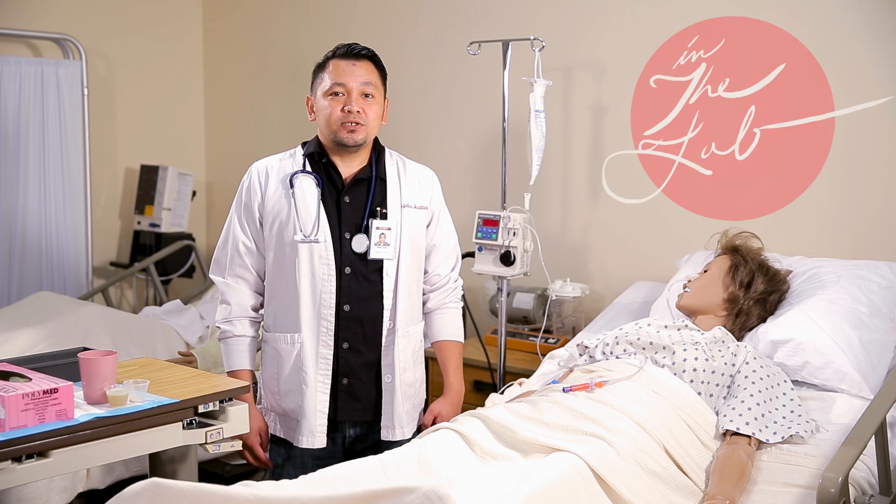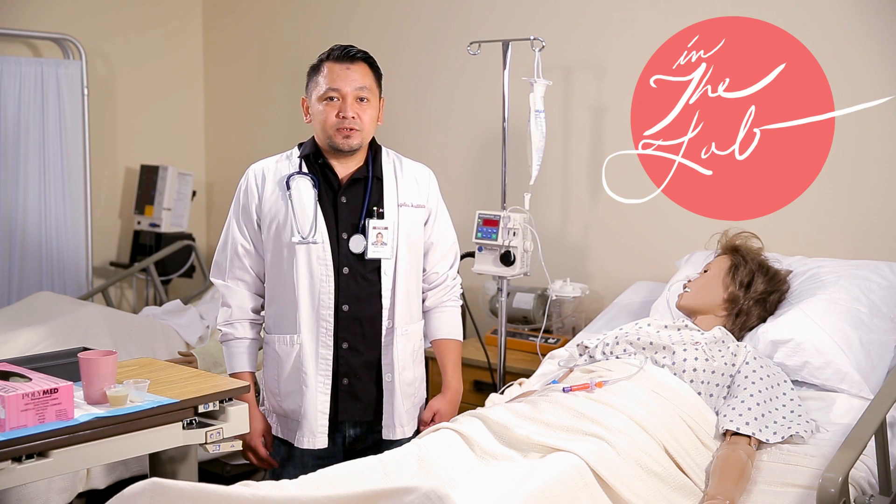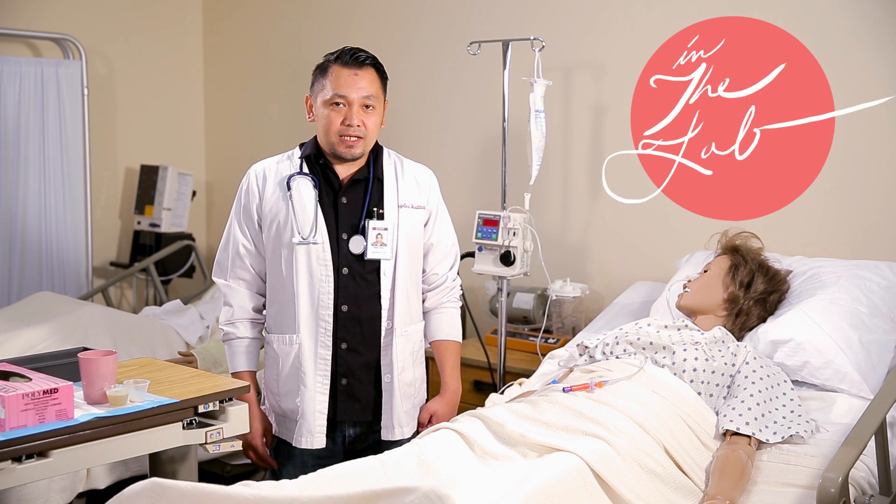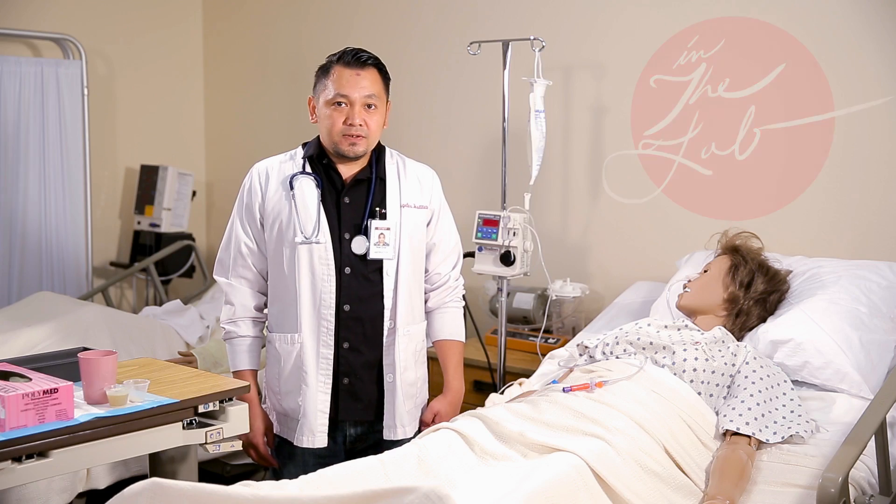Good morning, my name is Mr. Noel and welcome to Angeles Institute Simulation Lab. Today, I will be showing you the proper technique of administering nasogastric tube medication.